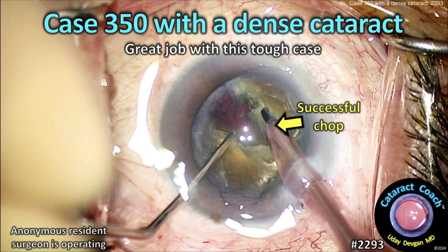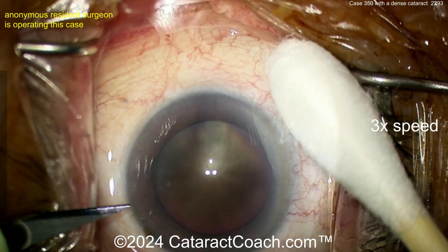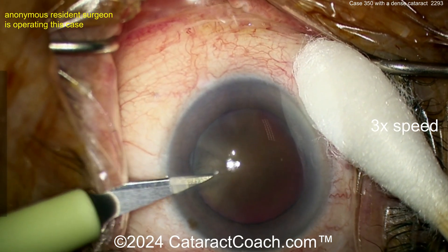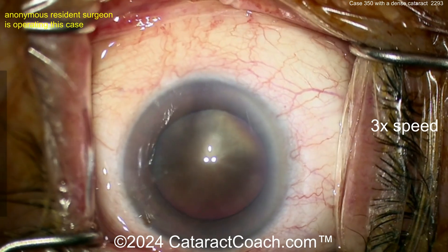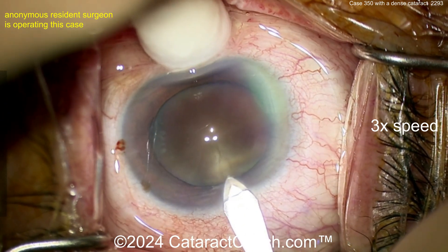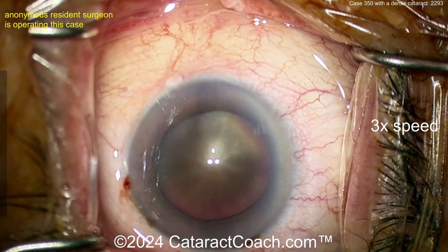CataractCoach.com, case 350 with a dense cataract. Hey, great job with this tough case. Now we talked about learning — case number 500 is probably halfway up the surgical learning curve, so for case 350 this is a beautiful job. Just keep in mind for your own personal skill set and level, at case 350 you're not even halfway up the learning curve.